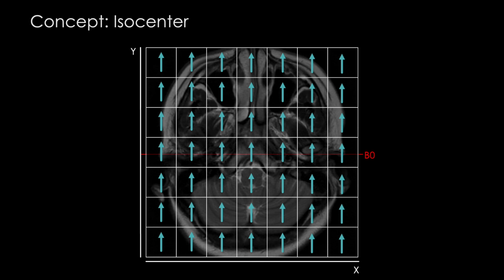Now your intuition may be to number these axes in the standard way, starting from 0 in the bottom left corner and increasing as we go to the right and upwards. But in MRI physics, as usual, things are a bit more complicated. Remember that all these little magnets are going to start spinning at some point, and this spin rate is predominantly determined by the baseline magnetic field B0, as well as any magnetic field gradients we apply across our slice, most commonly a gradient across the x-axis, as well as another gradient across the y-axis.